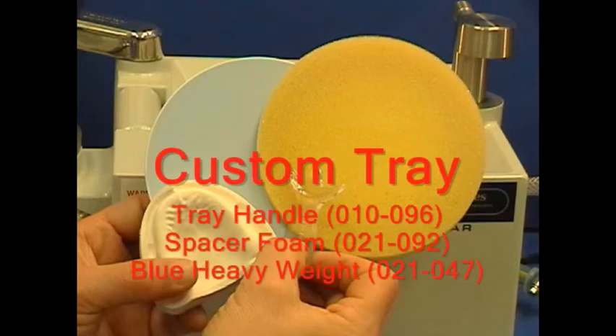Thermal forming materials for custom tray fabrication include a pre-formed tray handle, spacer foam, and 3 mm thick blue heavyweight material.